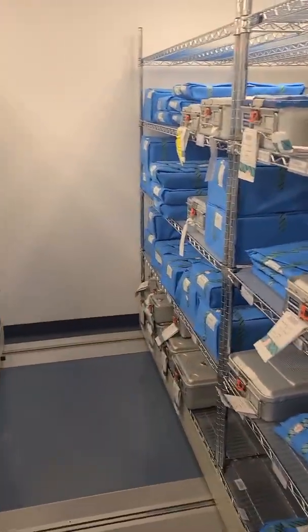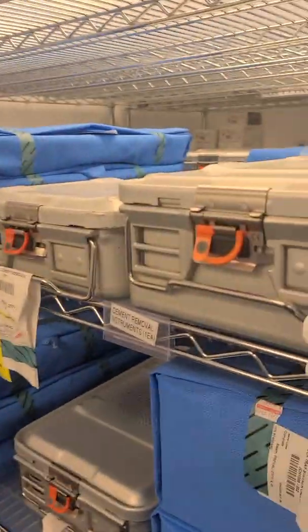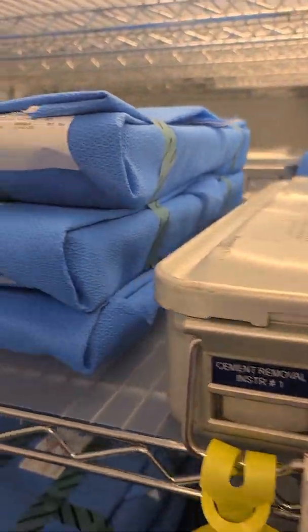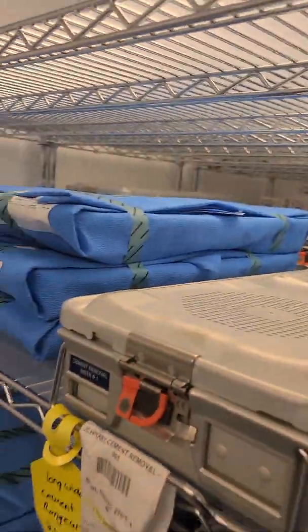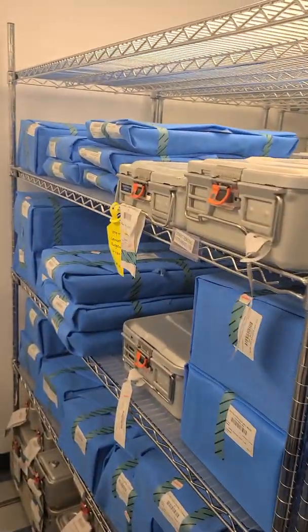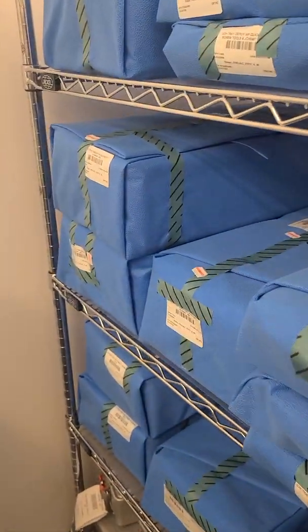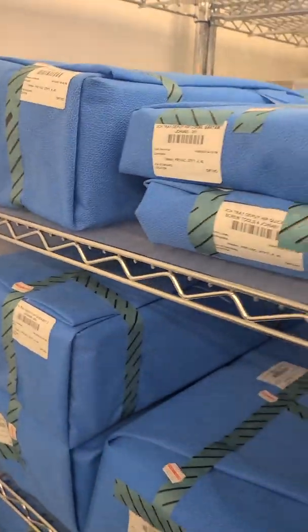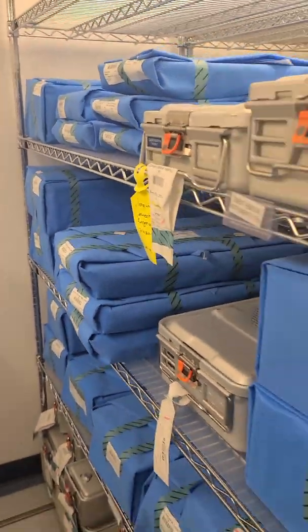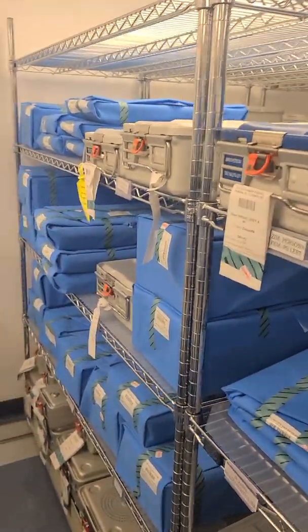It also tells you that wrapped items should not be stored underneath rigid containers on the same shelf. As you can see, there are no rigid containers on top of wrapped items here. It tells you to refer to the manufacturer's IFU for wrapped items on stacking, and that items should not be stacked, compressed, or bent, because it can compromise sterilization.